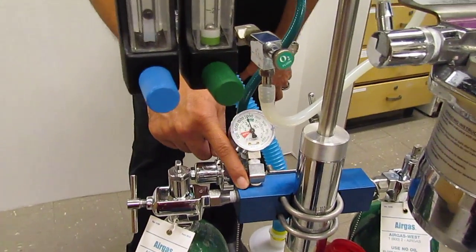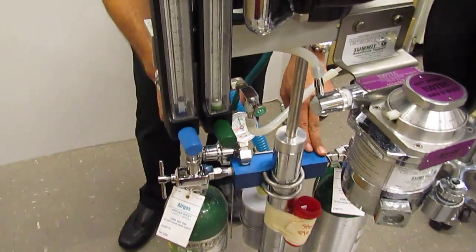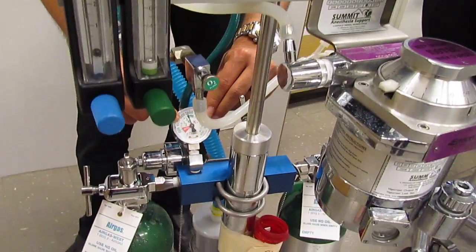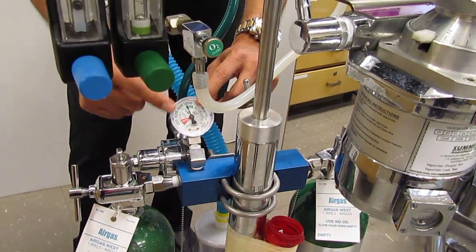Okay, from the yoke, we connect to the rest of the machine. You'll notice that then we go through the manometer that tells us how much oxygen we have. We already talked about that.